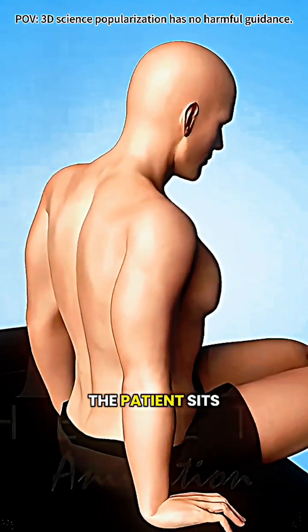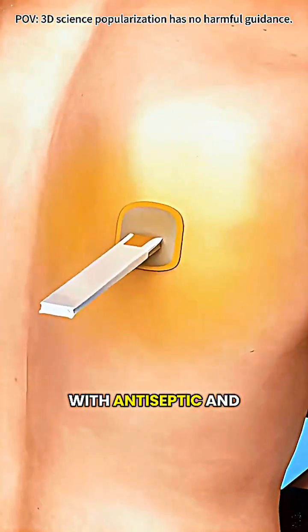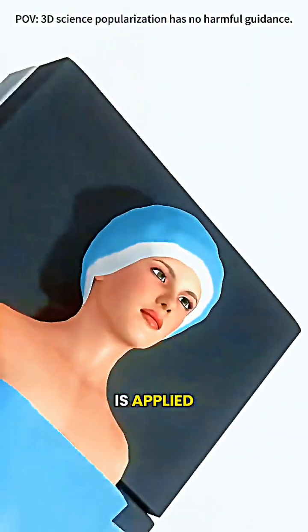To address this, the patient sits upright and leans slightly forward, exposing the back. The skin is cleaned with antiseptic, and a local anesthetic is applied, making the procedure painless.